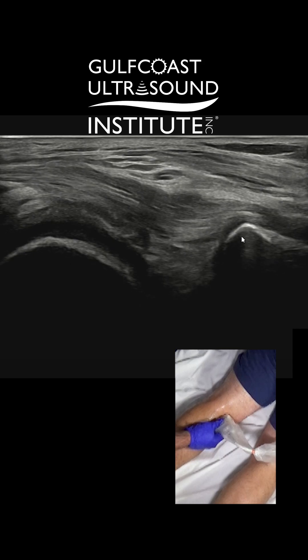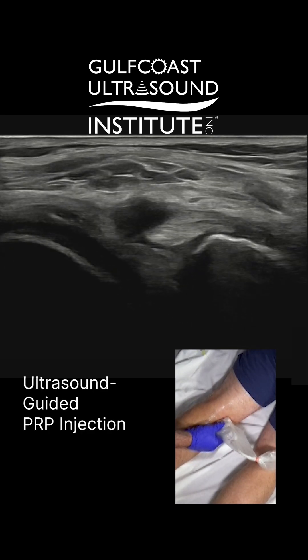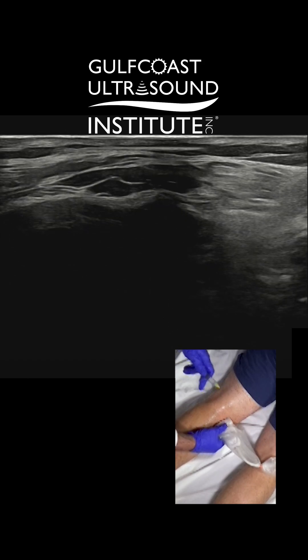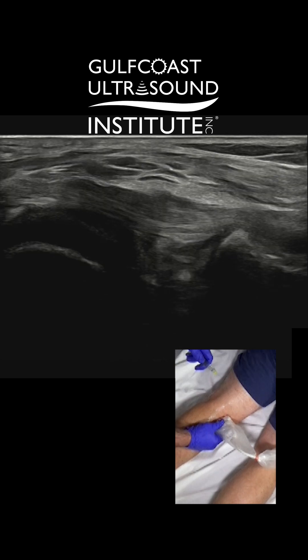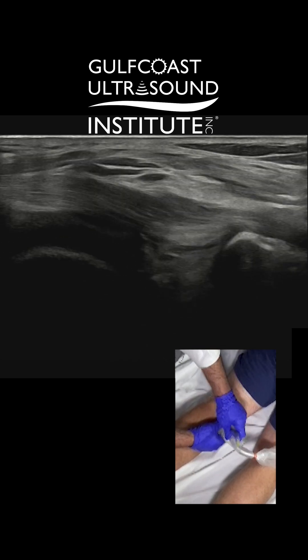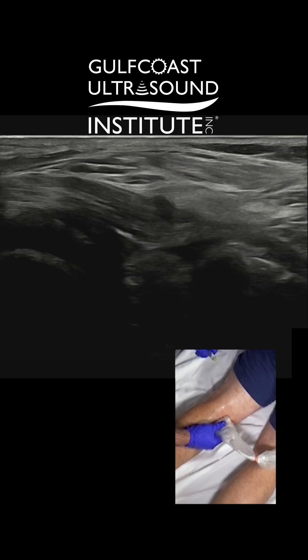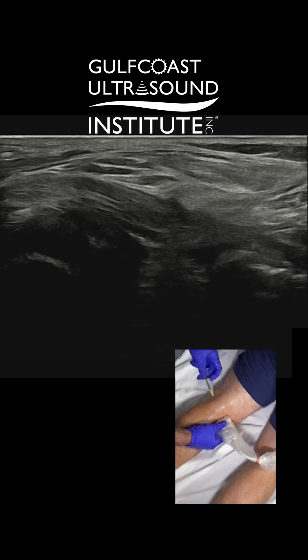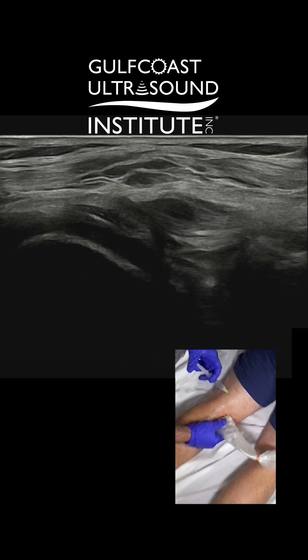So let's go right this way. When you do out of plane, usually most of these probes will have a little hash mark in the middle. So I'll center my structure here. You're going to feel a little poke, a little sting on three. I'm going to start superficial just to make sure I'm centered and make my little skin wheal. I want to make sure my bevel's up too.